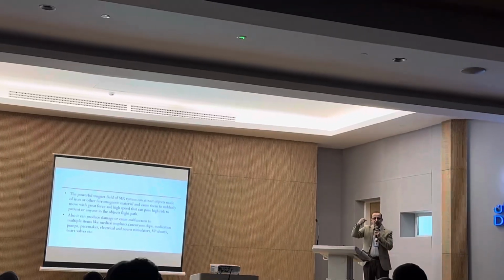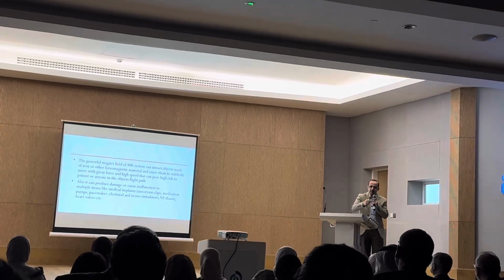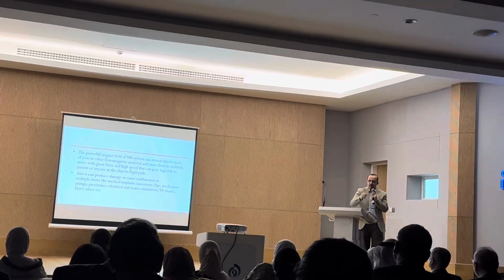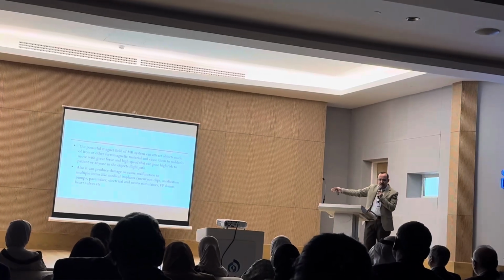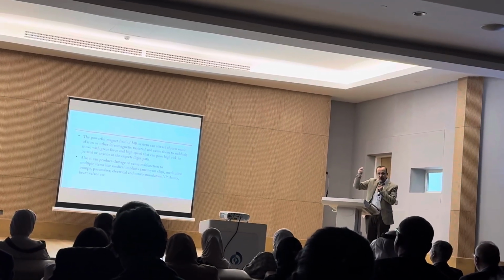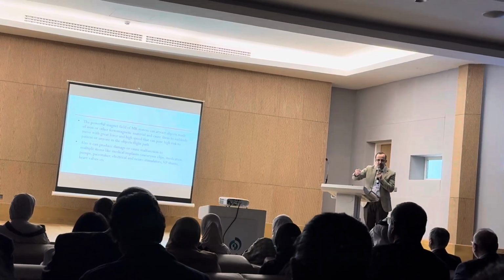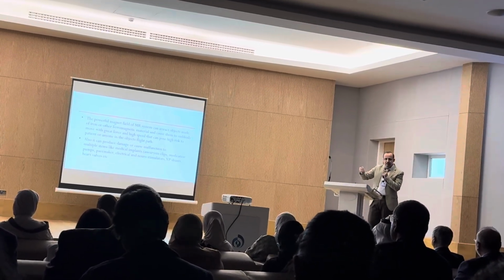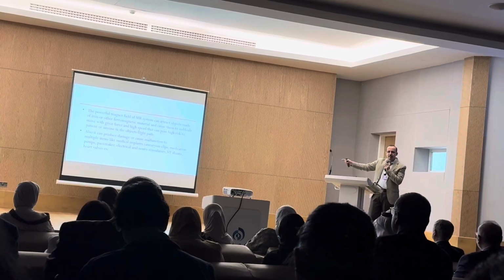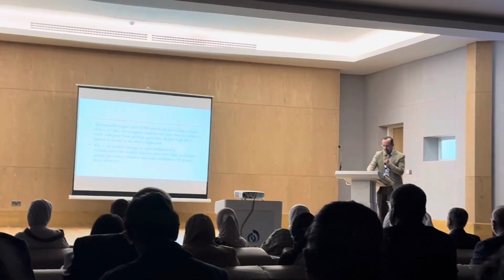If you call the engineer responsible for the device, he will manipulate it during the examination, and it becomes no contraindication for MRI. I'm talking about history, but if the patient has had this device previously, we can't guarantee its content, and it should be dealt with as highly risky material for MRI examination.